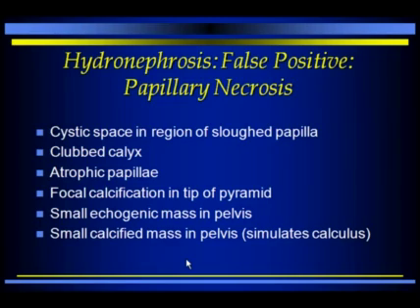However, you should be aware that it's also possible for papillary necrosis to be a cause of real hydronephrosis because the slough papilla may go off and actually obstruct the renal pelvis at the UPJ or somewhere in the ureter and can actually be a cause of hydronephrosis.